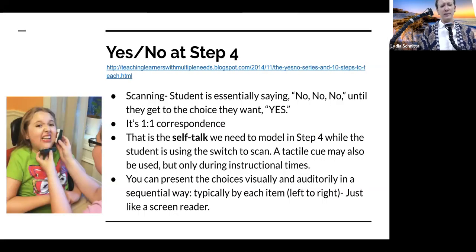This was a resource I wanted to share that goes with step 4, because although we're using the focuses on the iPad in this training, you really need to take it also outside of the iPad. And this is one way to do it. So you can see the switch is set up in a similar way to how I have mine set. And so ideally, yes would be a head move down. So this could be my select, and no would be a head turn.